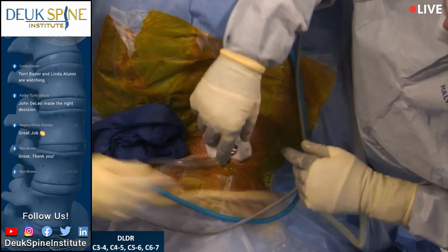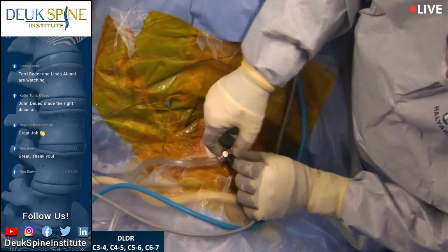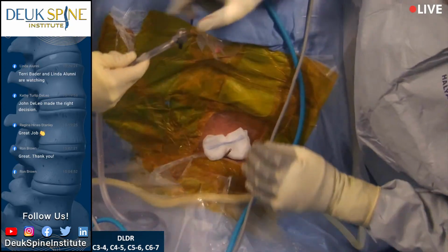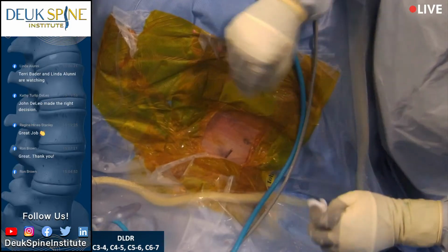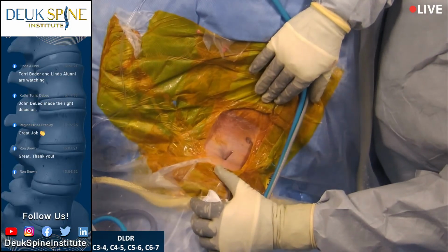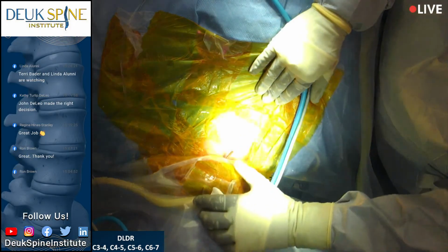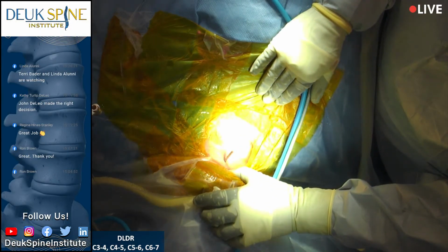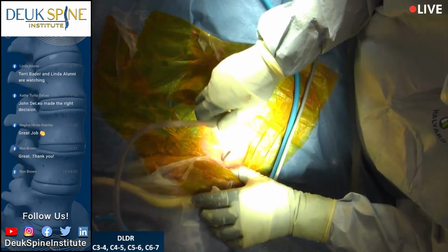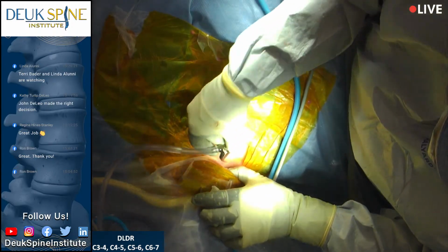I'm going to show you all just right here. You guys see this, Flynn? I'll need that. Can you see this? We need the light on, please. Lights on, please. And then can you see this, Flynn? Yes, sir. The whole surgery, 4 discs were fixed with 1 tube, 1 incision, from top to bottom.